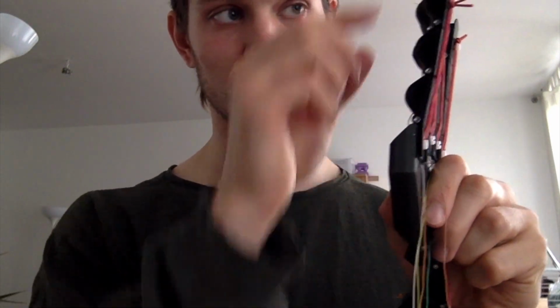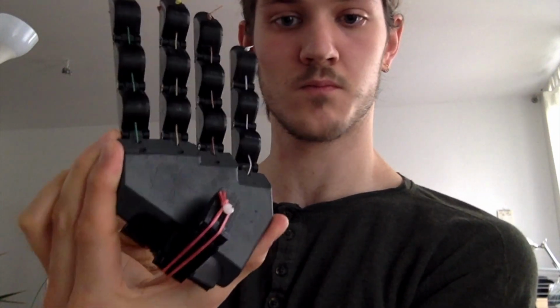In order to have the hand open by default, I've attached some elastic to each finger, which holds each finger under a small amount of tension. That way, when the cords are not being pulled, the fingers straighten out and the hand opens. We now have a good start on the hardware of our hand, and we'll leave it there for today.